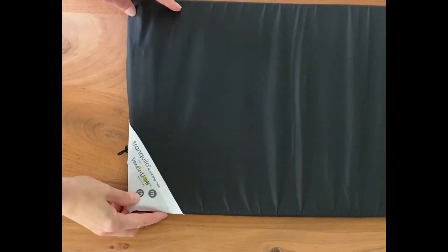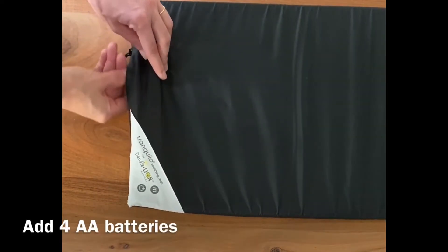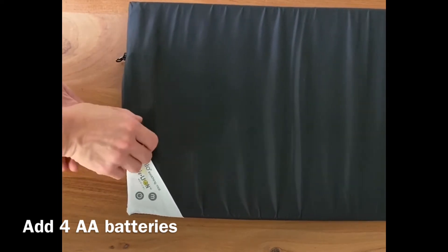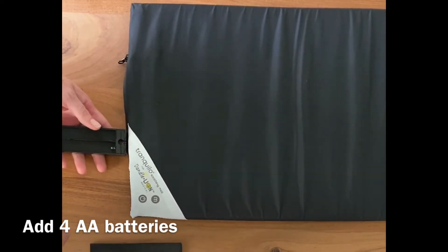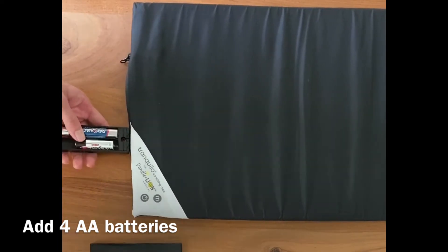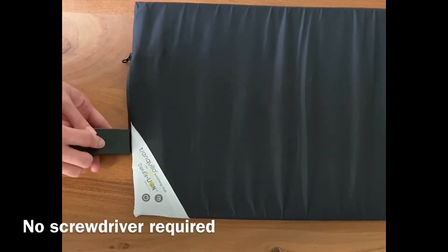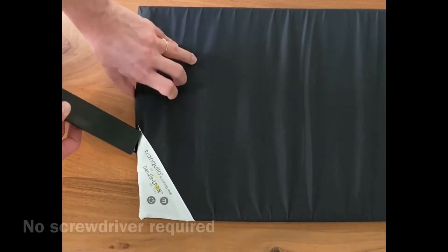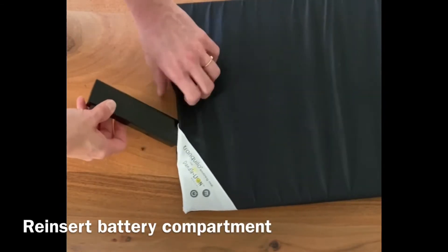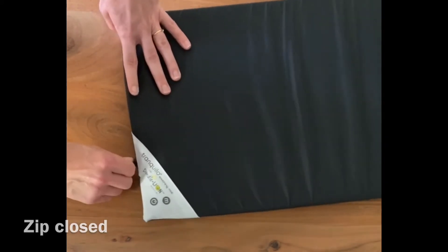Before using the Tranquilo in the care of a patient, you'll need to add four AA batteries. First, unzip the battery pocket, revealing the battery compartment. Slide off the lid and add the batteries. The lid easily slides off and on without requiring a screwdriver. Return the battery compartment to the end of the mat and zip closed.